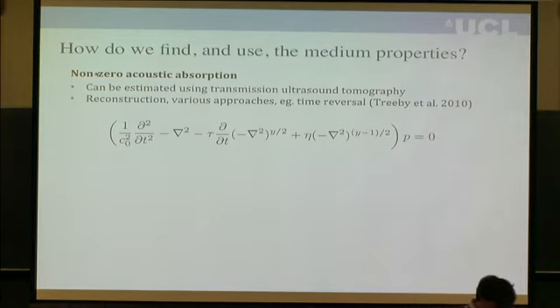Acoustic absorption increases hugely as you go to higher acoustic frequencies. So by taking it into account, it's possible to recover some sharper features in your image. Of course, you need to regularize when you do that. There's a number of papers on this.